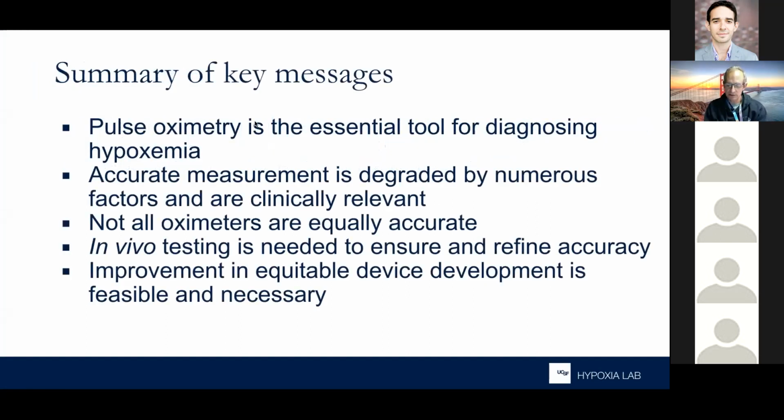My key messages today will describe the way that the pulse oximeter has become the essential tool for diagnosing hypoxemia. The non-invasive nature of the technology and the low cost of pulse oximeter instruments have positioned it as a transformative monitor everywhere on the planet. I'm going to talk about the technology that underlies the measurement technique that pulse oximetry uses.